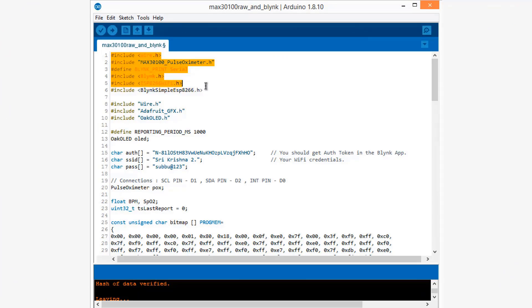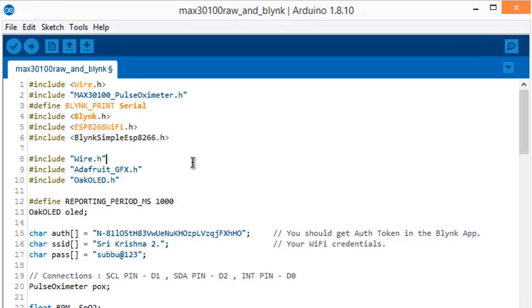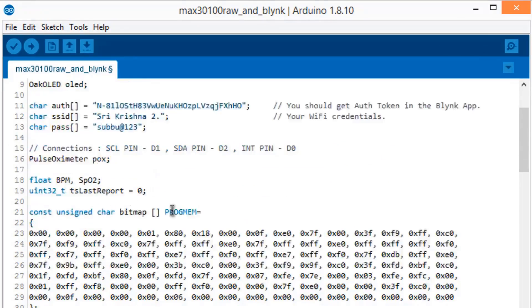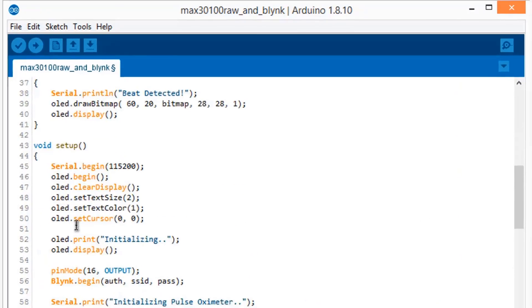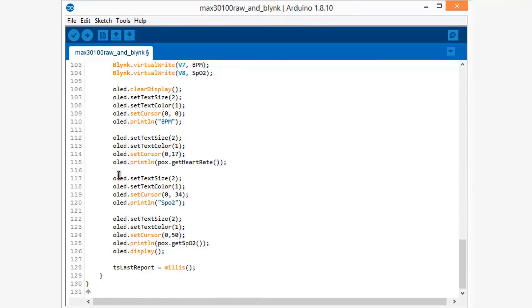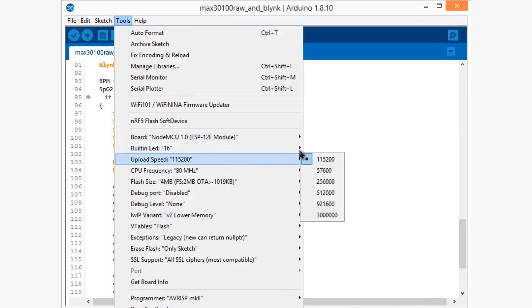Now let's look at the code. First, you need to install a few libraries. Since I am using the Blynk Android app to monitor data, I installed the Blynk library and a few OLED libraries. Get the Blynk authentication token from the Blynk app, then change the Wi-Fi SSID and password. This character is for displaying a heart sign on the OLED screen. The rest of the code reads the interrupt and measures the BPM and SpO2 values, sending them to the Blynk app using virtual pins V7 and V8.